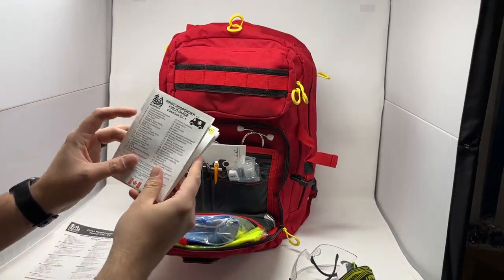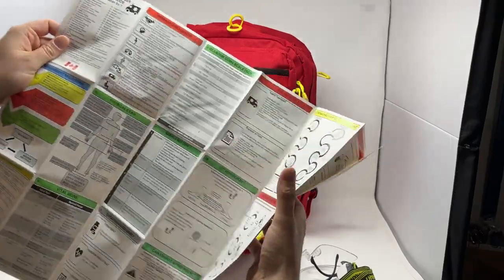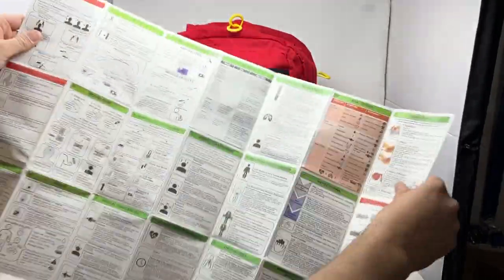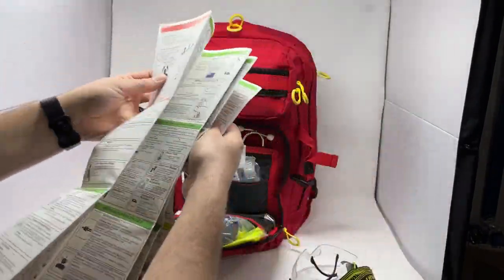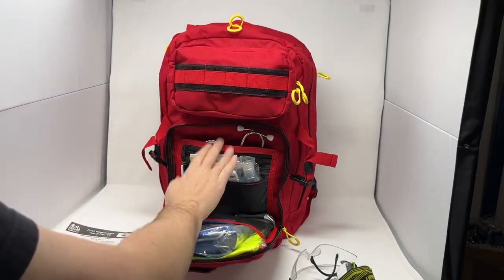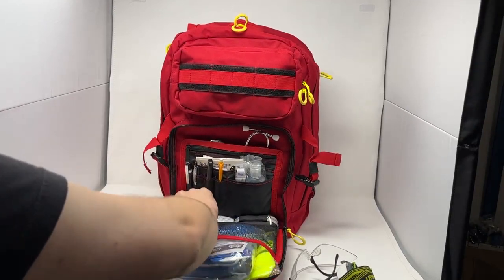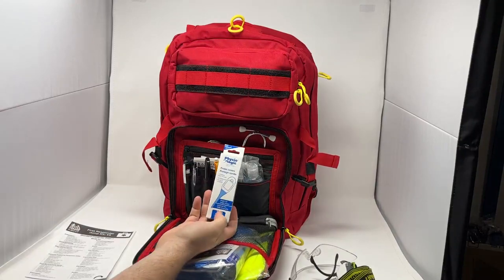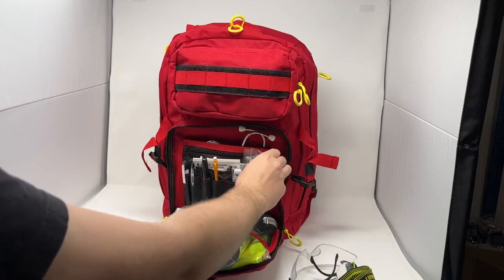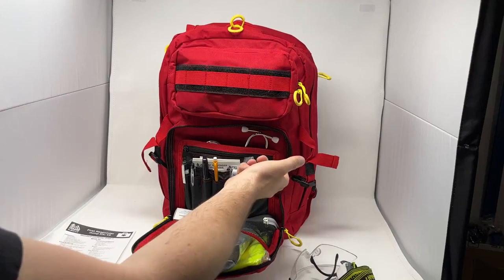We have our waterproof Canadian First Responder field guide. This is a full map to first aid with an overall encompassing review of just about every topic covered. It's a great field guide and it is waterproof, tear-proof paper as well. We have a digital thermometer, and with that comes 100 probe covers so you can use it safely between patients. We also have a 30 ml hand sanitizing bottle.